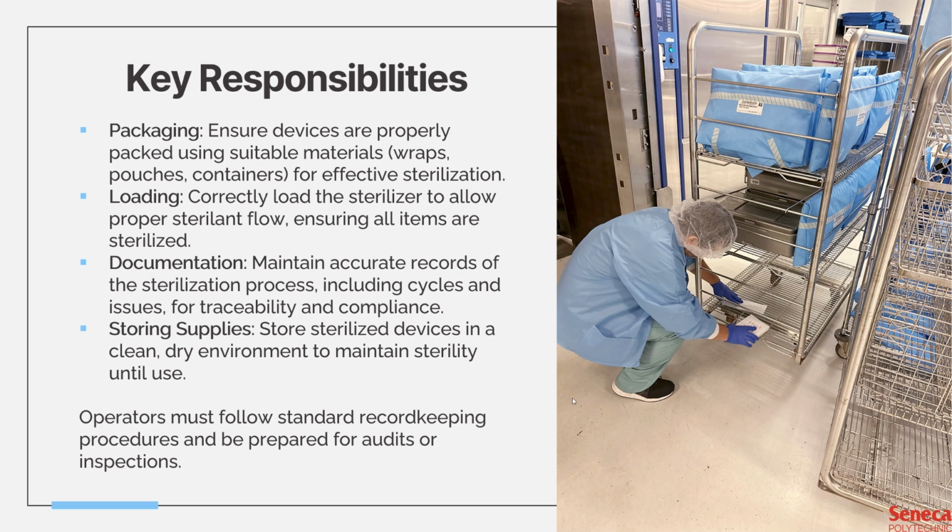So for the most part, you do have to quality check their work, but only externally, right? You have to make sure they have tape. You have to make sure they have external indicators. You have to make sure they're using the tamper evident arrows for these rigid containers. And you also have to put the biological indicators, of course.